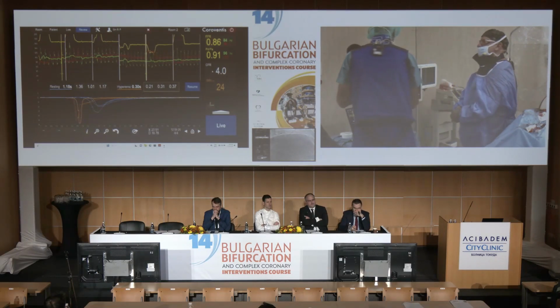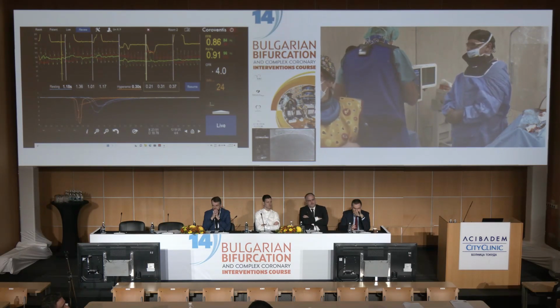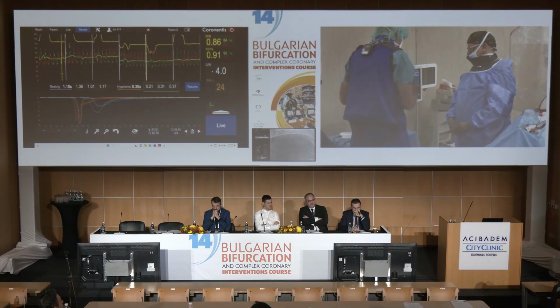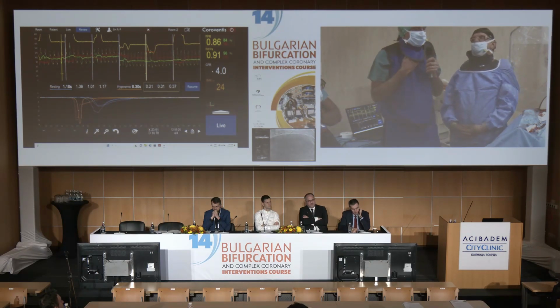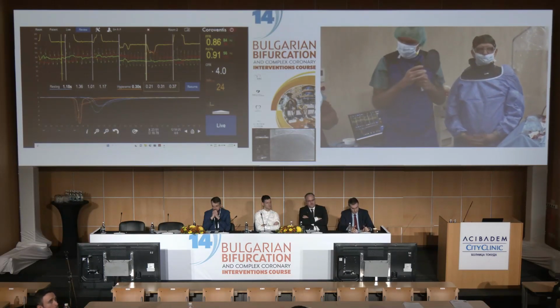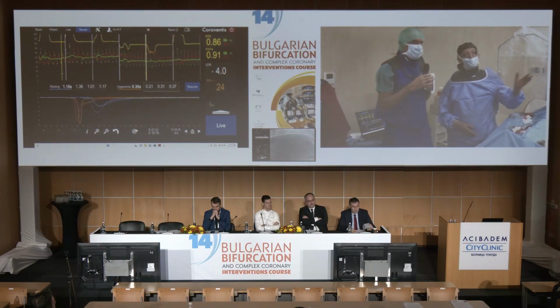So this is, in a nutshell, I know we are going fast for those who never saw that before, but for those who have done that 2 or 3 times, they understand that very well. This is bolus thermodilution. I would propose to stop here for a second, because if there are questions in the audience or questions in the panel, it's the moment. And in the meantime, you can give the reflow catheter and everything for continuous thermodilution.